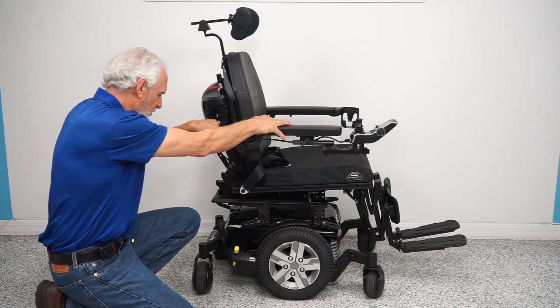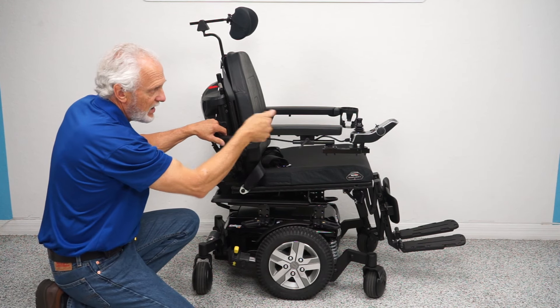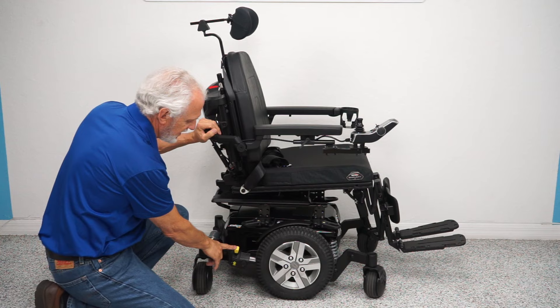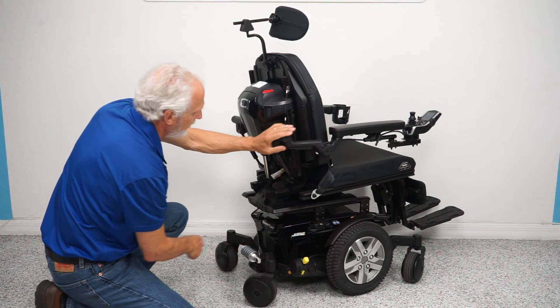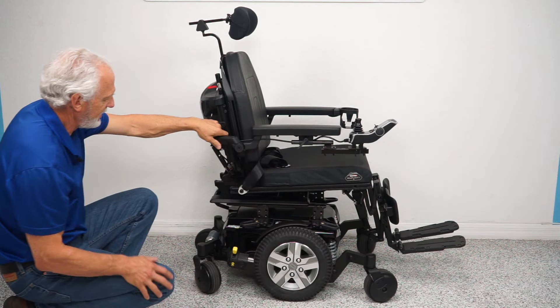If you want to push the chair manually, you can't push it while it's in gear. Turn the power off first — you want no resistance in the motors. Then find the yellow lever, push it down, and now you're in neutral. You need to do both motors. When you're done, put it back in gear.